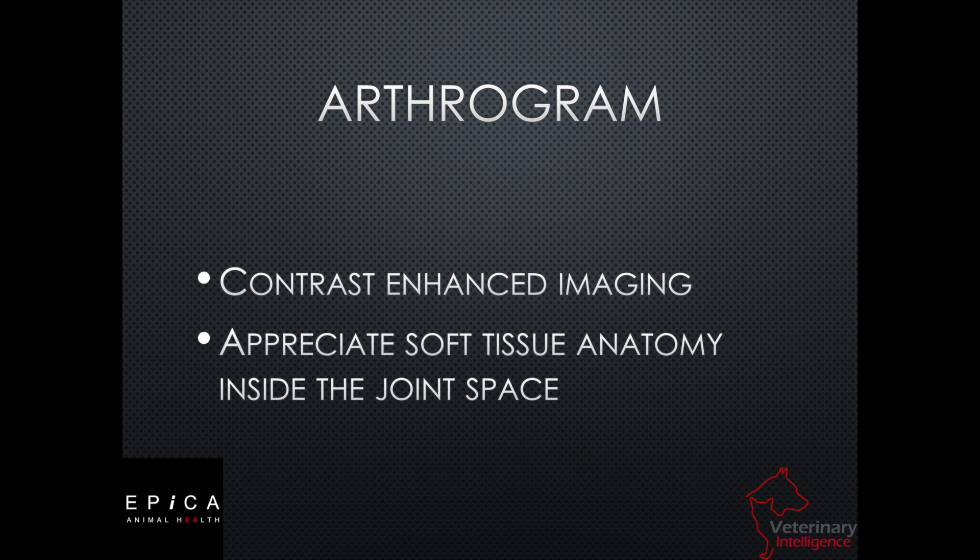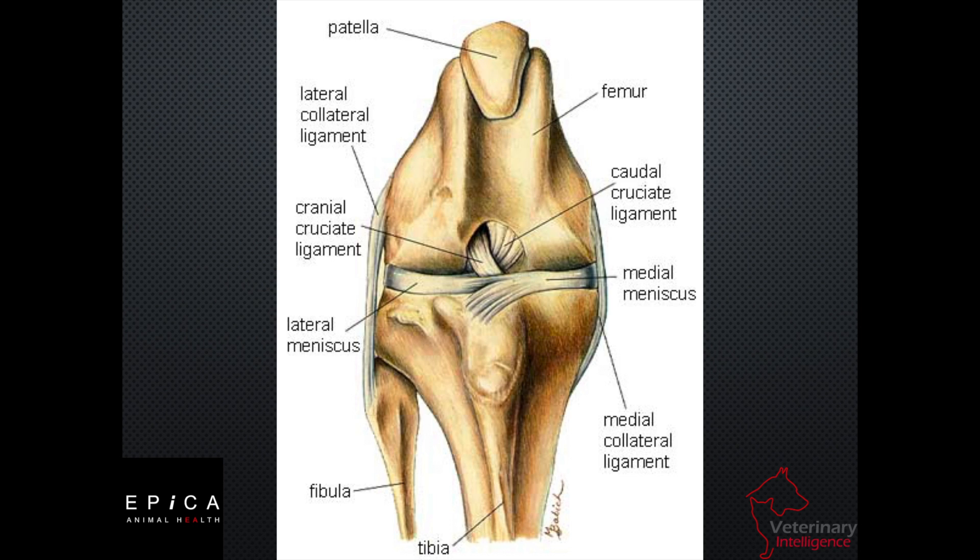This allows us to appreciate soft tissue anatomy inside of the joint space. If we look at our sample of a canine joint here, we can see all of those soft tissue ligaments and, of course, the meniscus and even the cartilage. We cannot appreciate that just in a regular image without contrast enhancement.